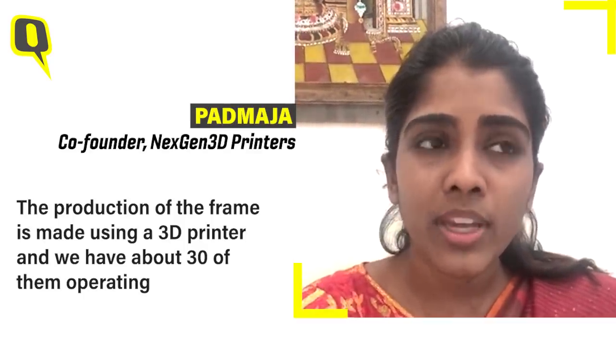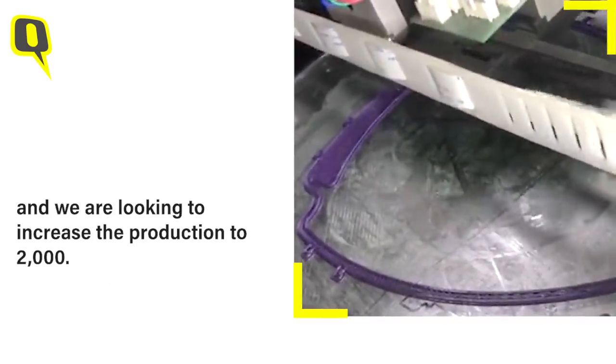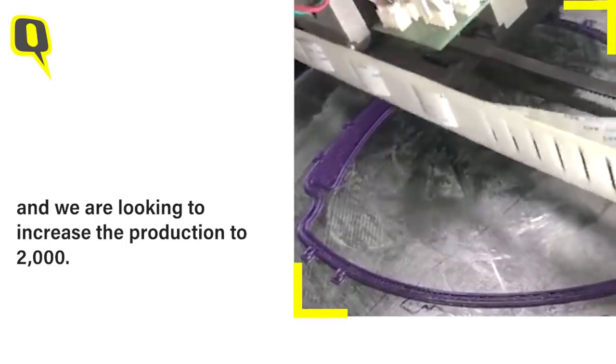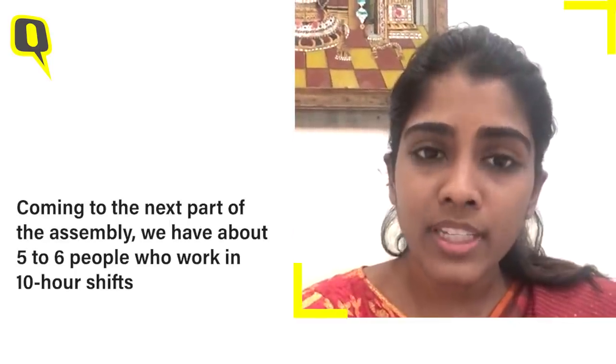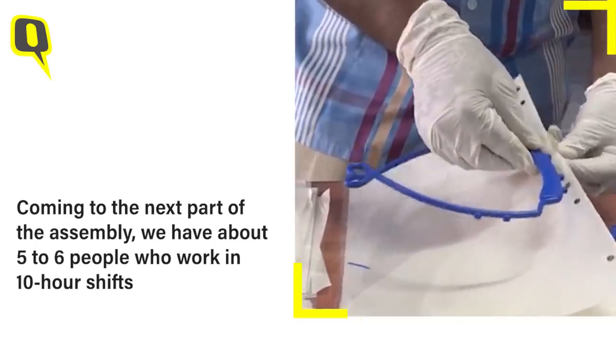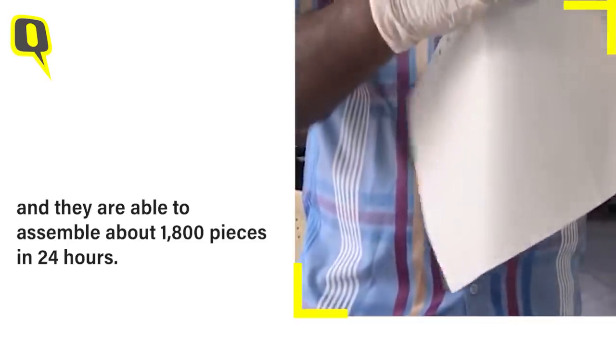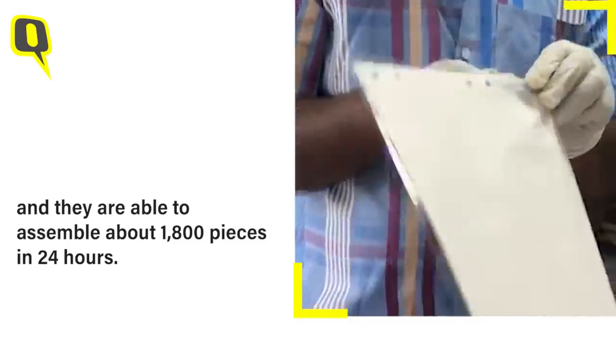The production of frames is made using 3D printers. We have about 30 of them operating, and each frame takes about 30 minutes, so we are able to produce somewhere around 1,500 frames a day. We are looking to increase the production to 2,000. For assembly, we have about 5 to 6 people who work in 10-hour shifts, and they are able to assemble around 1,800 in 24 hours.